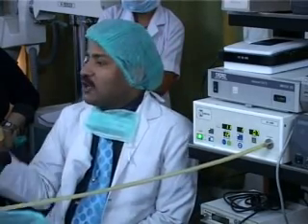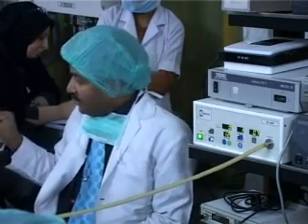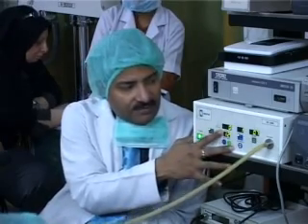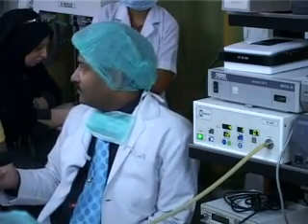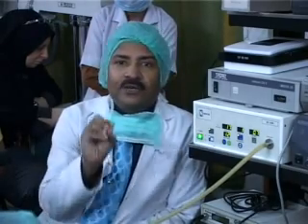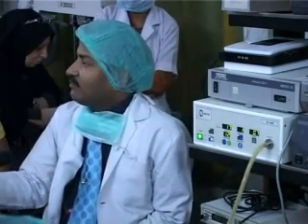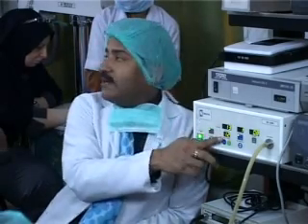And actual pressure can only be sensed when the insufflator is off, when it is not pushing the gas. That's why you can see here it is sometimes 13, sometimes 4, sometimes 15 and sometimes 0. That means actual pressure is 0. It senses the real abdominal pressure when it is off. When it is on, when it is pushing the gas, at that time it will sense the resistance of the flow, and that's why it is giving the error.